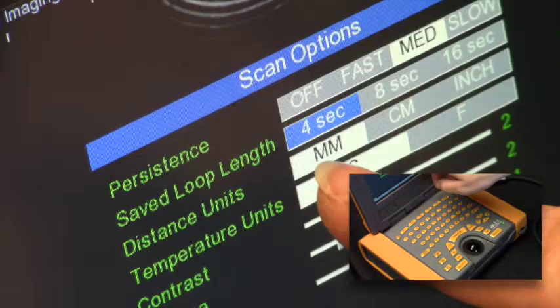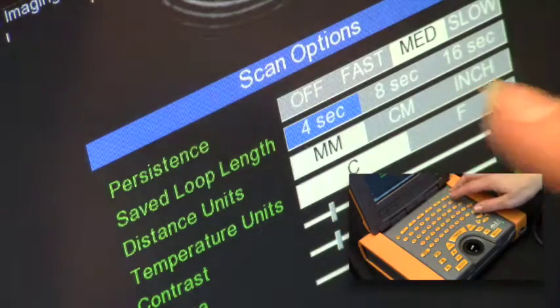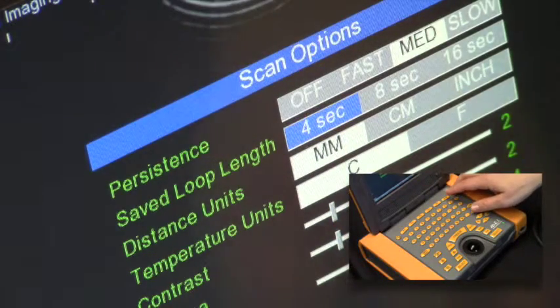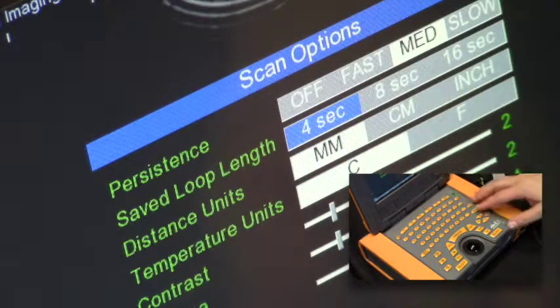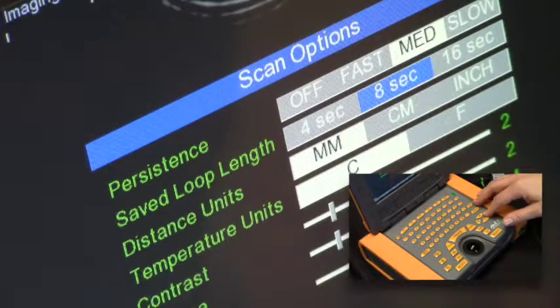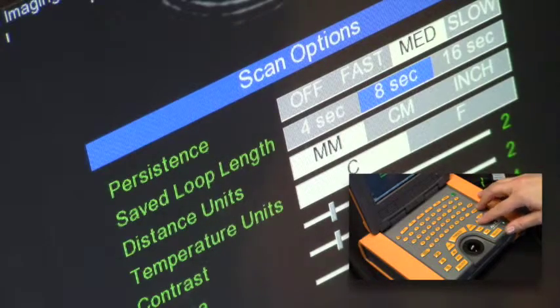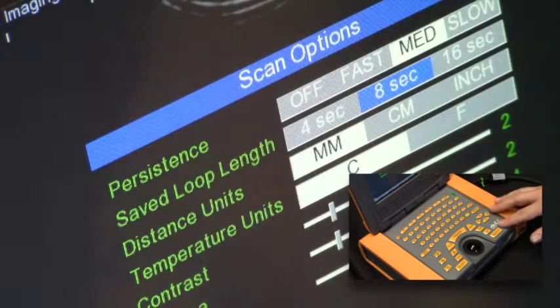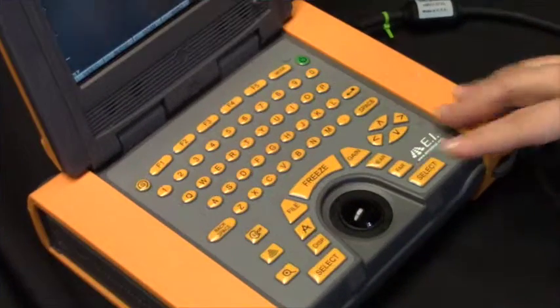The factory default setting will be 4 seconds, but I'm going to use the arrow key to select 8 seconds, and then hit select to commit that.